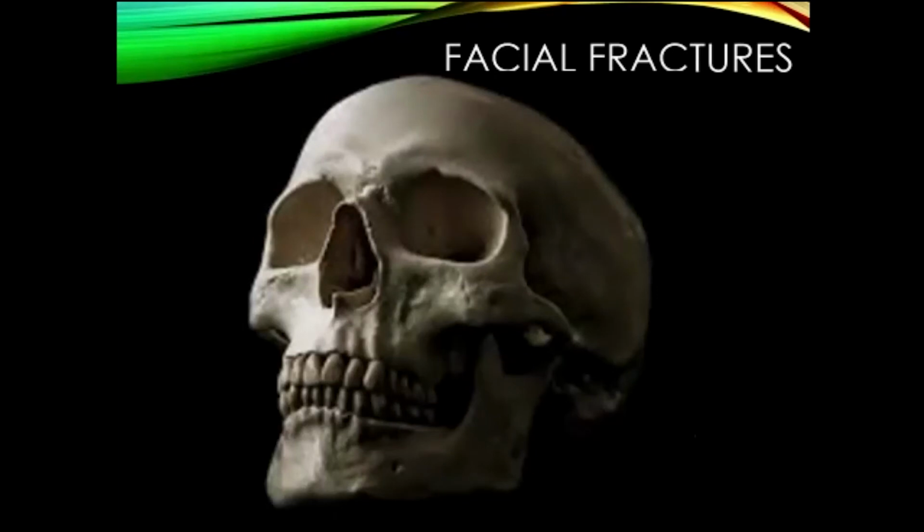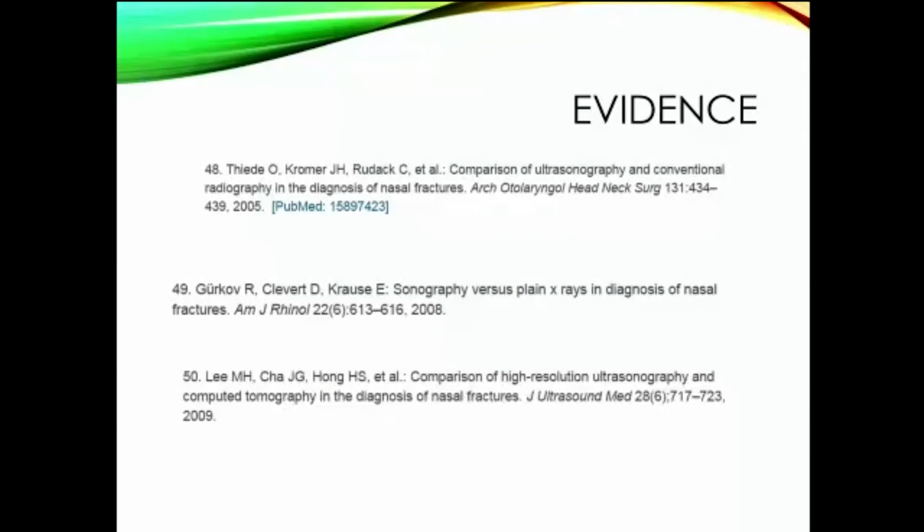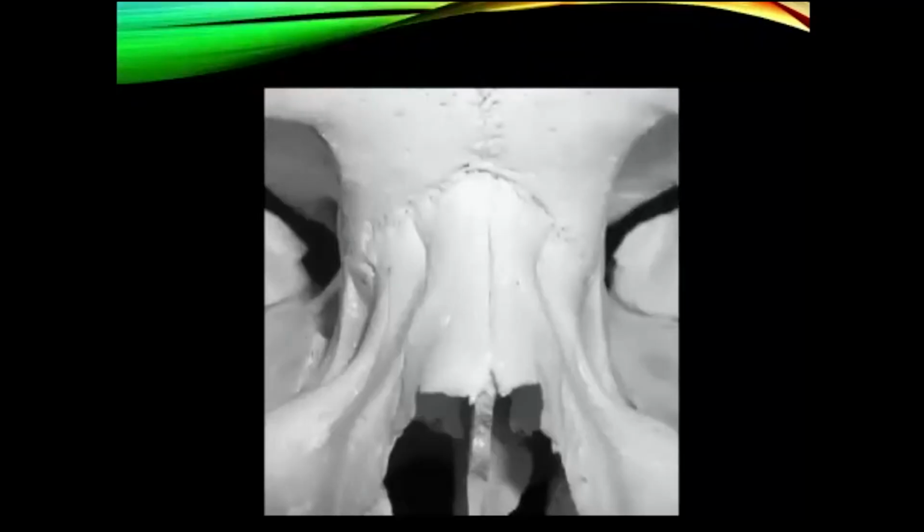Another area that's been looked at is facial fractures. So we can scan the bones of the face. There's been some interest in this in ENT. And you'll notice that the studies, there's one in the Journal of Ultrasound Medicine in 2009, and then a couple of studies in ENT journals, looking at the nasal bones in particular, and the maxilla and the zygoma.